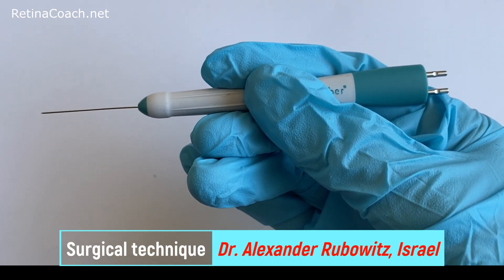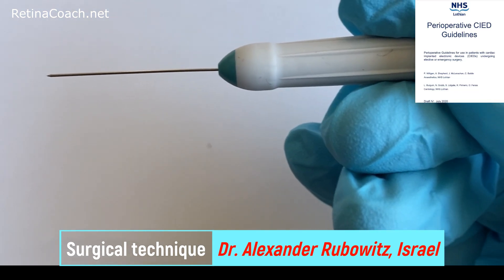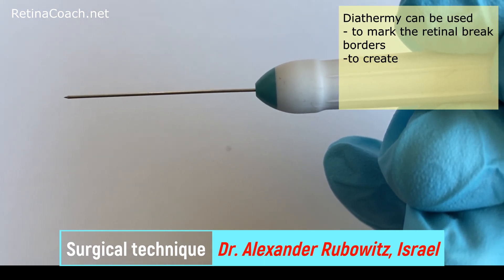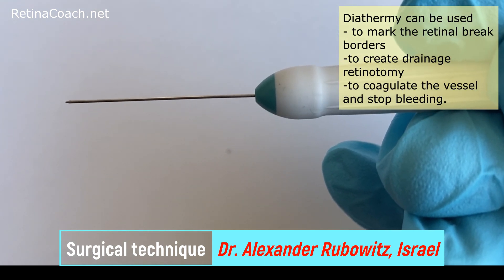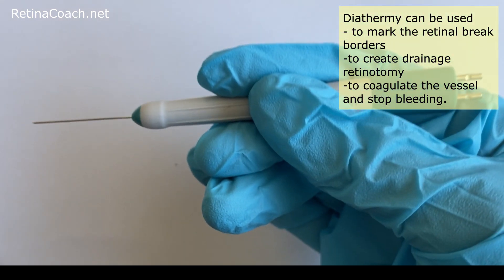Therefore, in contrast to monopolar diathermy, it can be safely used in patients with cardiac pacemakers. Diathermy can be used to mark the retinal break borders, to create drainage retinotomy, coagulate the vessels and stop bleeding.